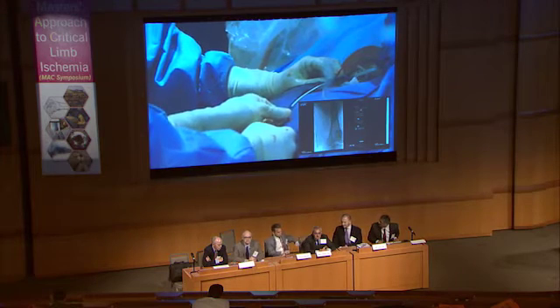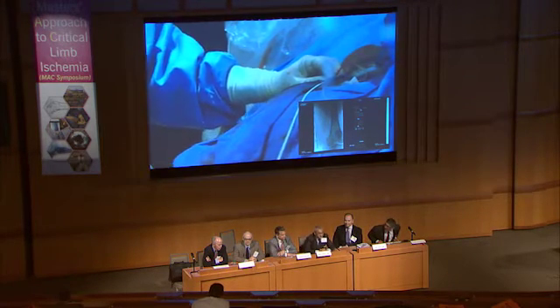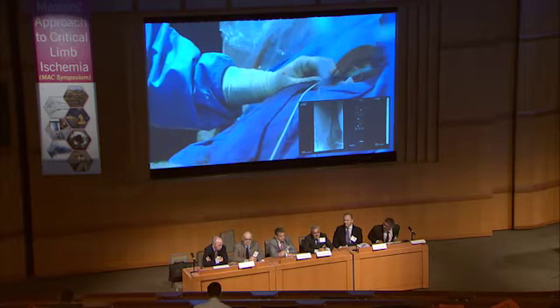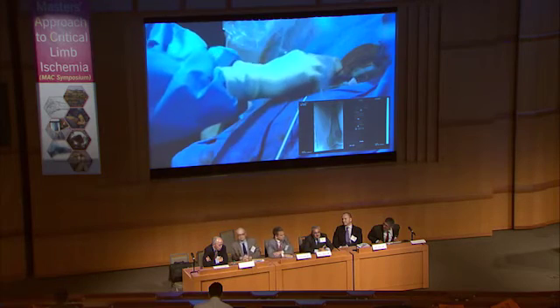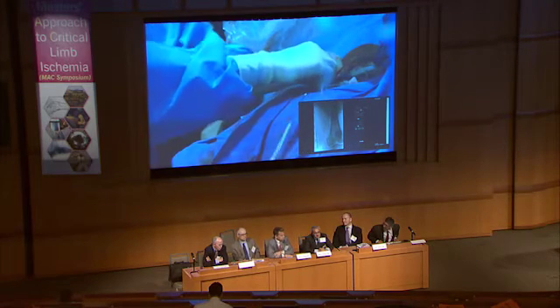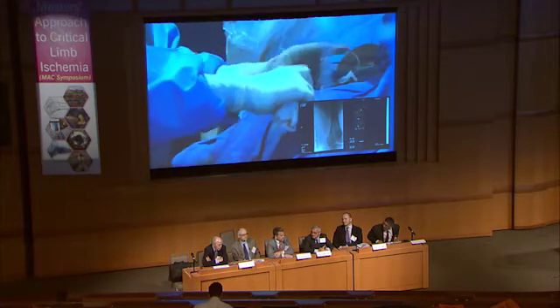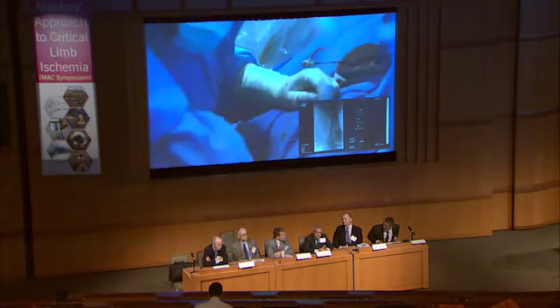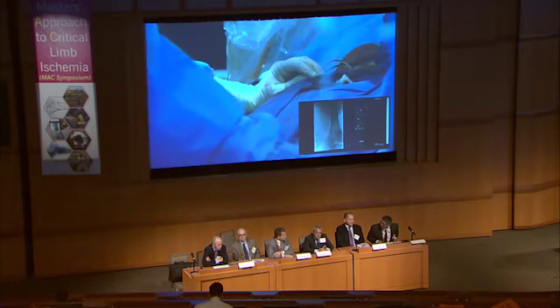Alec, any suggestions regarding imaging before Viabahn, after Viabahn, assess the distal edge, distal vessel? Yes, no? No, he's already dilated outside of where he's going to implant this, so that's a done deal already. So no, I picked Hunter's Canal as the main target zone and maybe put 5 down, 10 up and go. So let me get more specific with Dr.